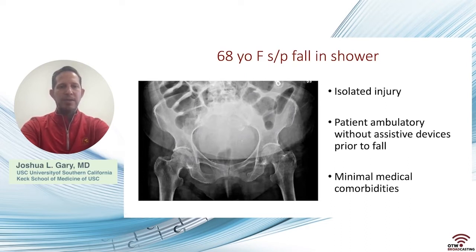The plain X-rays, you don't see much. I think one thing that's notable, that's common in these patients, you can see the distension in the bowel gas. She's presenting a couple days from her injury, so a lot of times these injuries can get missed or seen at outside places and not treated. And then they can come in with issues with going to the restroom, both urinary retention and issues with constipation. And you can see some of that on our X-ray here.